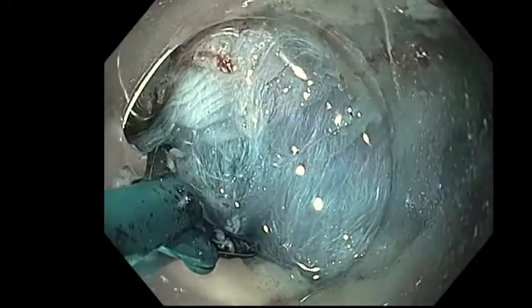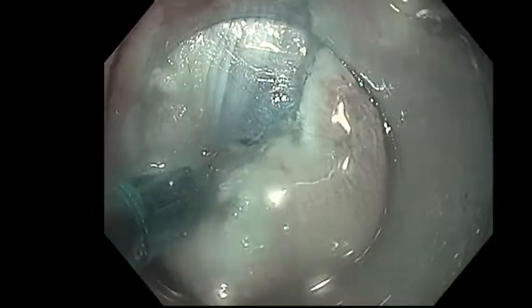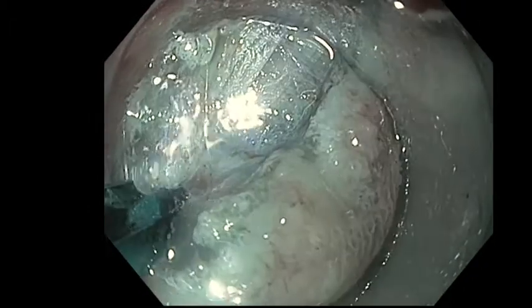Starting submucosal dissection before cutting all circumferential, otherwise we lose the traction from the mucosa. For thick vessels, precise grasping and certain soft coagulation could avoid bleeding.